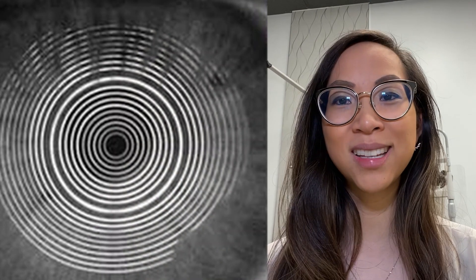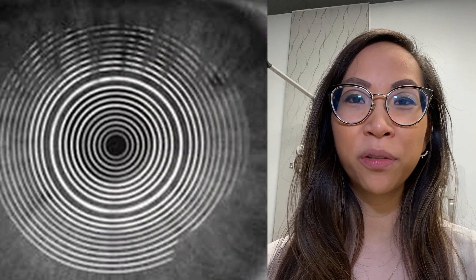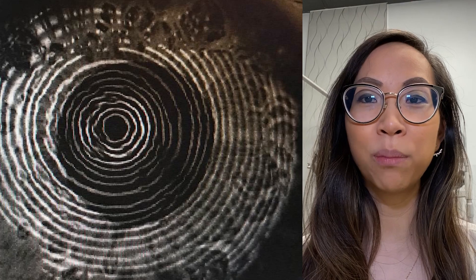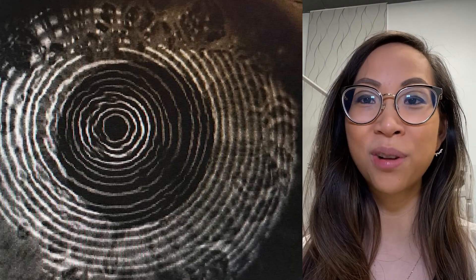When the mires are crisp and distinct, we can infer that the tear film is relatively healthy, while a wavy pattern can point to a cornea with surface dryness.